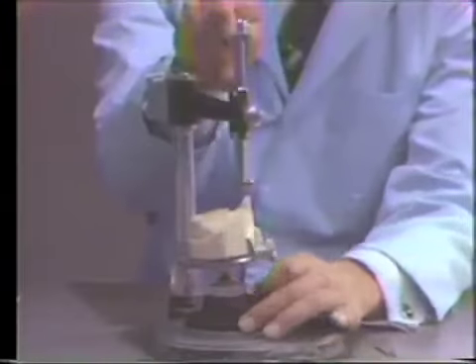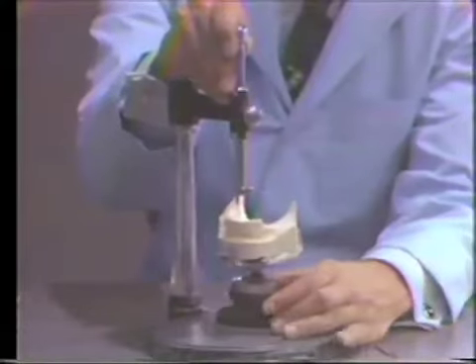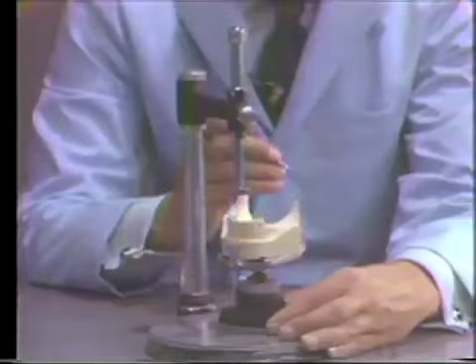crowns. Now I'm going to look at the third tooth that we're going to check. The third tooth that the potential partial would check would be the potential indirect retainer spot, which is the first bicuspid on the patient's right side.